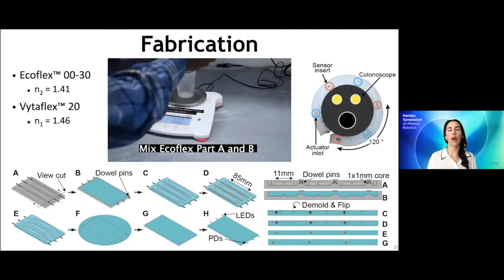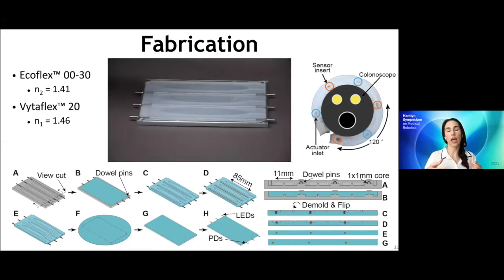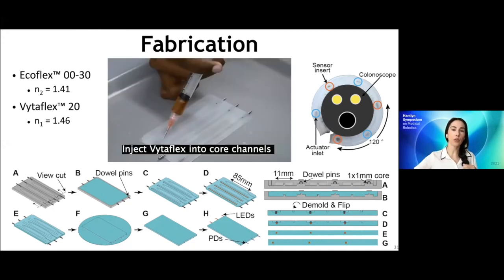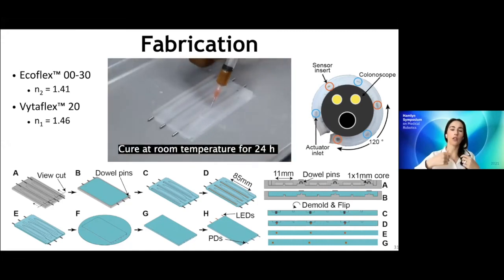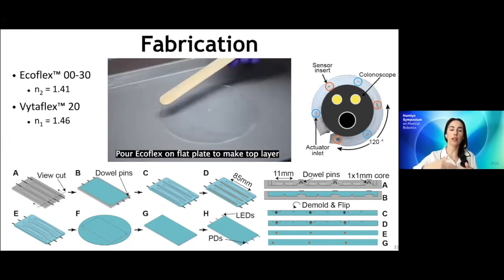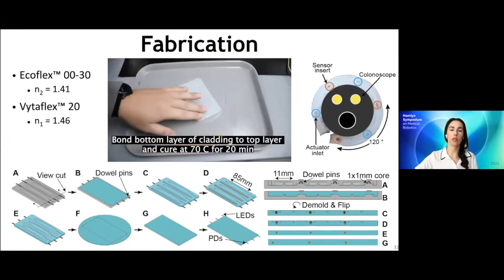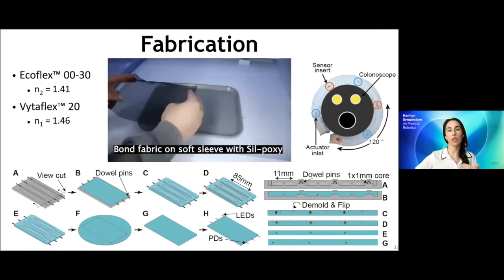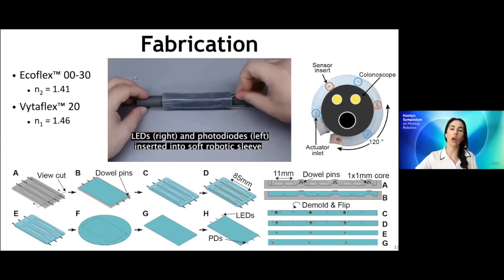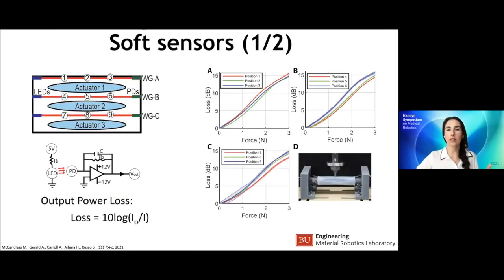And so these are created by embedding inside your soft robot soft materials that have different refractive indices, such that they can guide light through your optical sensor. They are intentionally lossy with respect to a traditional rigid optical fiber. In that way, as the material is stretched or pressed, the light that is transmitted through the soft optical sensor changes, and you can relate that to the inputs that you want to measure. So we have characterized our soft sensors.